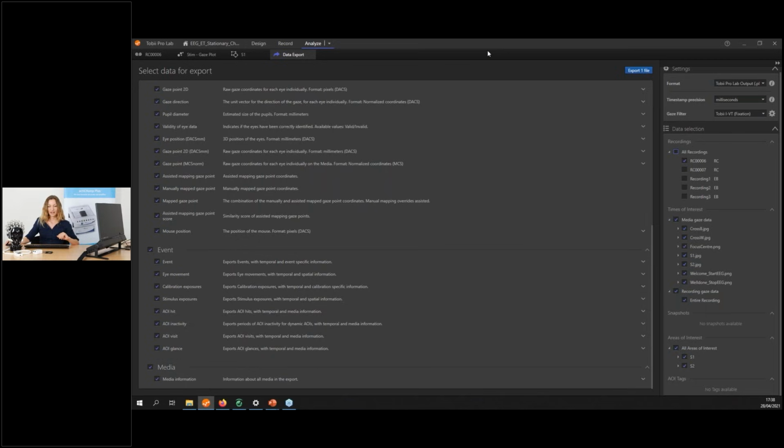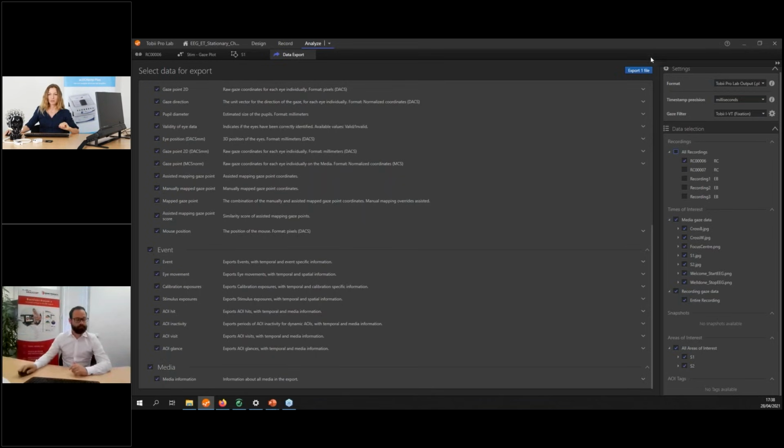So at this point, I would already like to hand over to my colleague Michael. So we have now analyzed the eye tracking data. We have exported this file from our longer recording. And now Michael is going to show you how to work with this in BrainVision Analyzer.